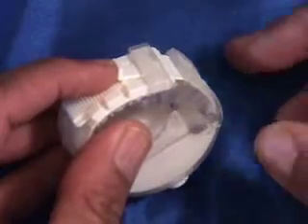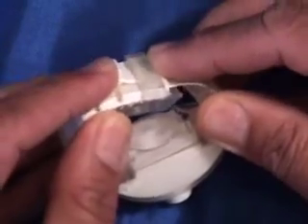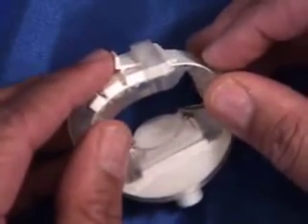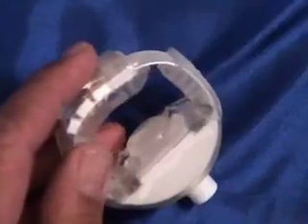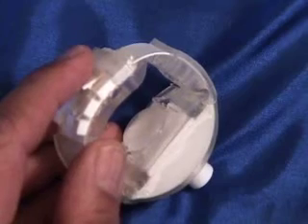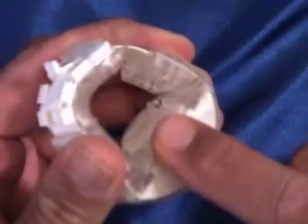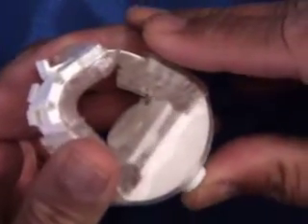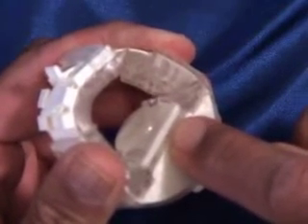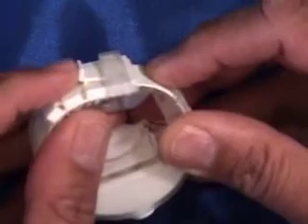If this does not allow adequate space for urination, then it might be necessary to lift the tab up and release the strap and loosen the device so that urination can be accomplished. Once urination is achieved, the device can be secured again by retracing these steps. Compress the device from sides so that there is some gap between the elevation and the penis. Press the button to push up the soft elevation to compress the urethra. Release the compression and tighten the device to a comfortable position.